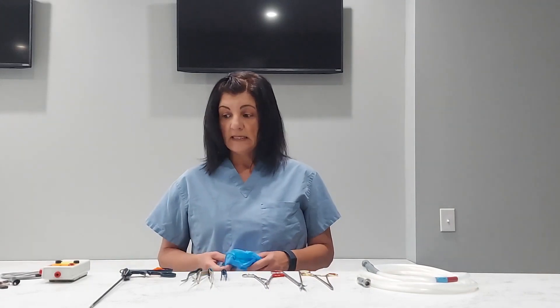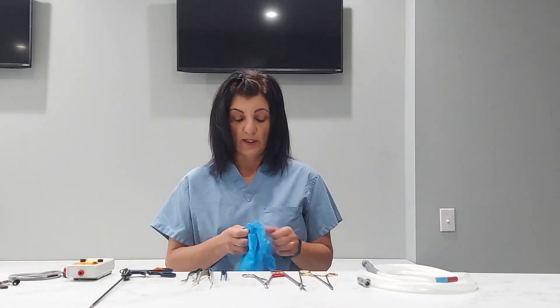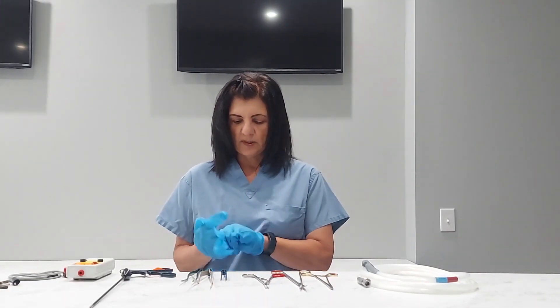The first thing you want to do is read the IFU for your insulation tester and find out what PPE you are supposed to be wearing. Typically it's gloves to help reduce and prevent shocks. So I'm going to put my gloves on.